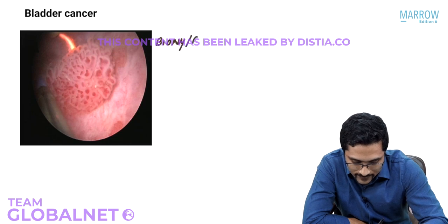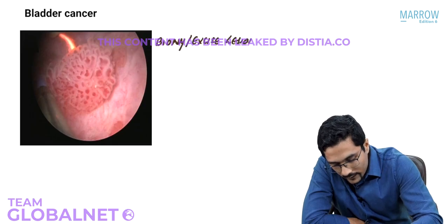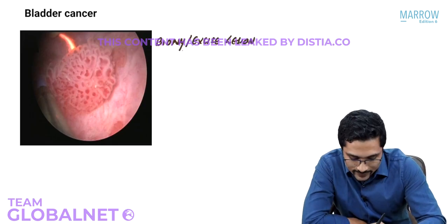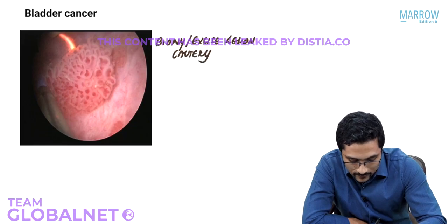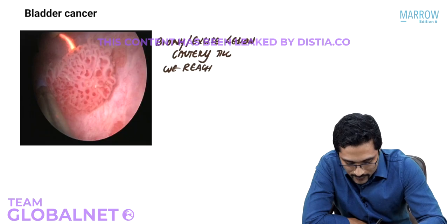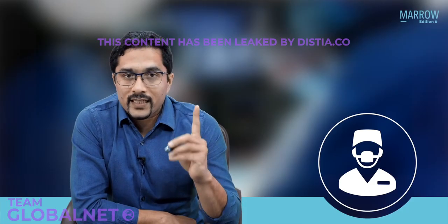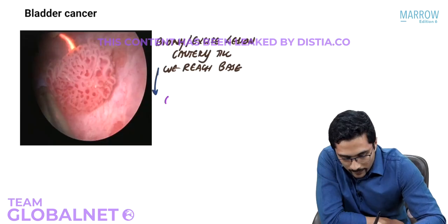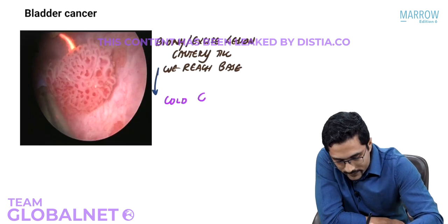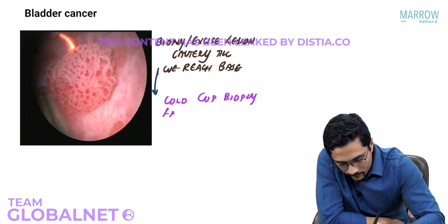or basically excise the lesion. We can excise the lesion, and this can be done using cautery till we reach the base of the lesion. Once we reach the base, then it is very important for you to understand that I will do a cold cup biopsy from the base.